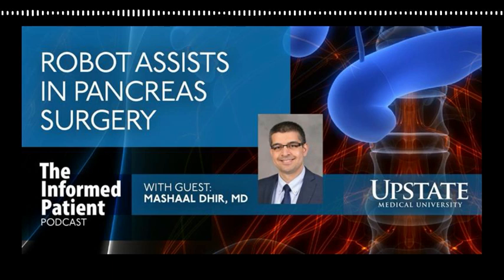We have to blow up the belly with the gas, create the space, and work around the blood vessel. So, in general, it takes in our practice about 8 to 12 hours, depending on how extensive the disease is and how easy it is to dissect the tissues.